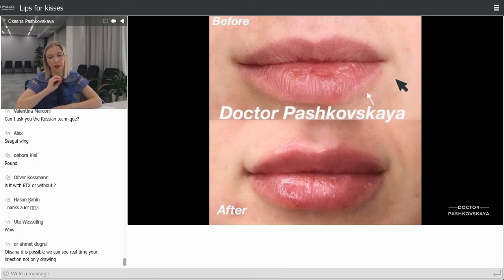So in difficult cases, when you have doubts which preparation you should choose to still be safe, I recommend you to use Alexa.